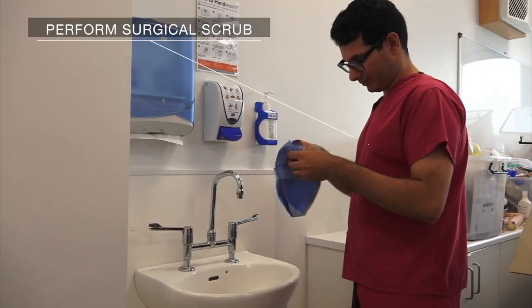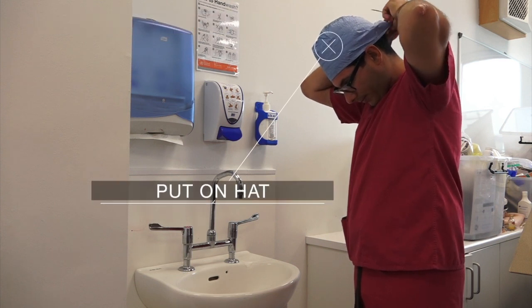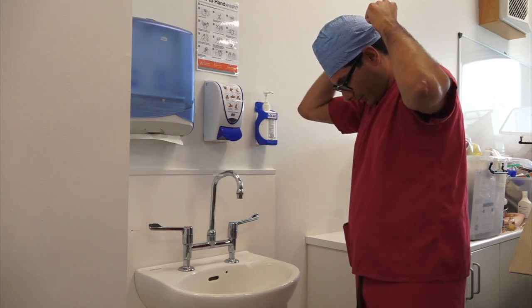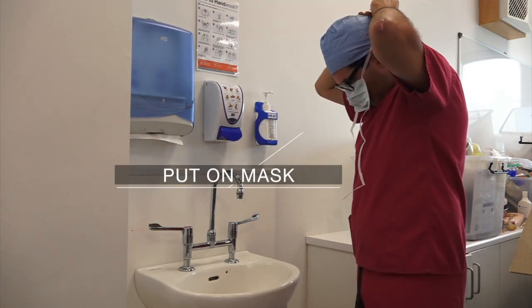Prepare for the sterile procedure by performing a full surgical scrub. Put on a surgical hat, then put on a surgical mask.